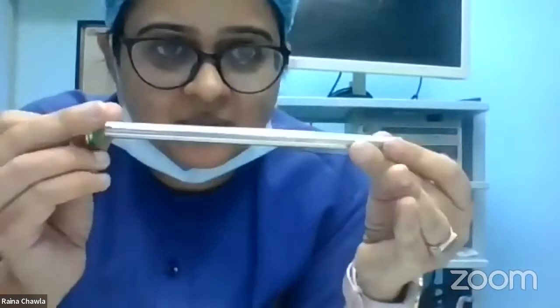You have an image monitor, a camera system, a light source, and a gas insufflator. To create the pneumoperitoneum, we use a Veress needle. And then, once the gas is in the abdomen, we use primary ports and secondary ports to create our operating site.